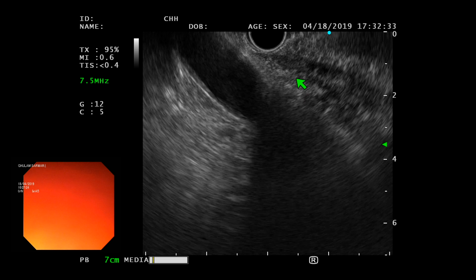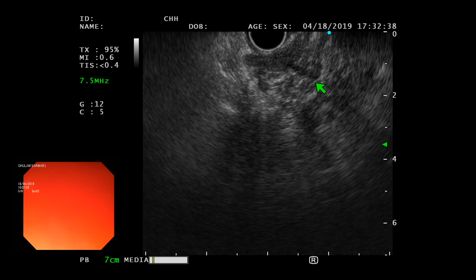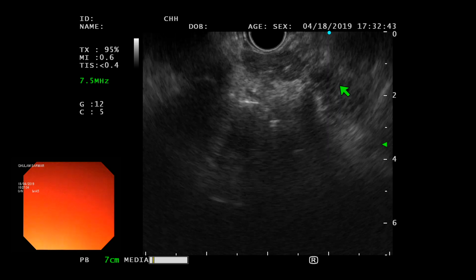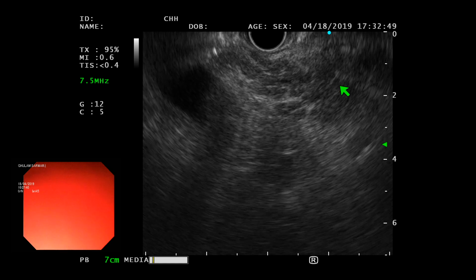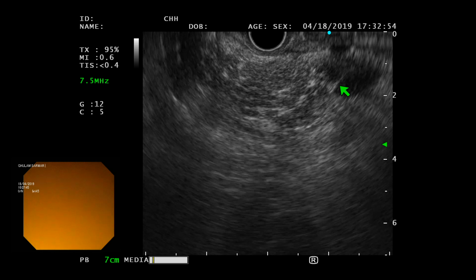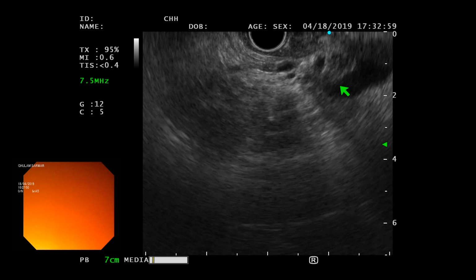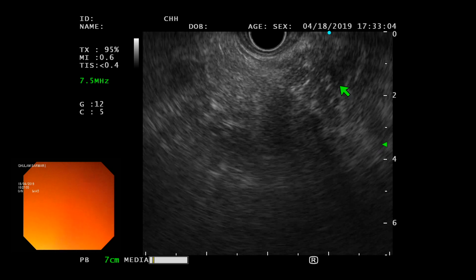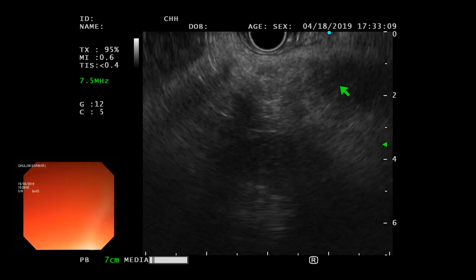So here, right now, I'm going to unlock all my wheels. I'm right at the ampulla. You see the pancreatic duct. This area I have seen. So I'm going to forget about this area. Come back. Now I'm going to just pay attention to the pancreatic duct area. Coming back. I still have that pancreas. And you see that I'm almost falling into the stomach now. Right there, I fell into the stomach. You see the duct right there. Coming back, and I fell back into the stomach, and that's where the rest of the pancreas is.